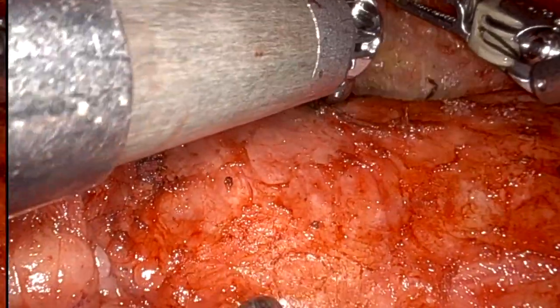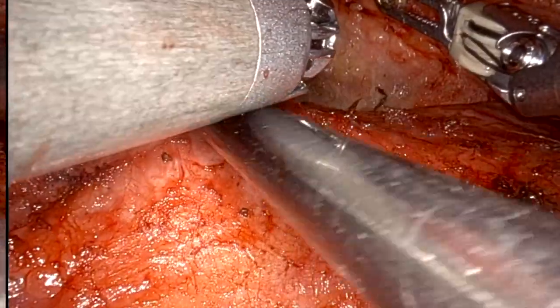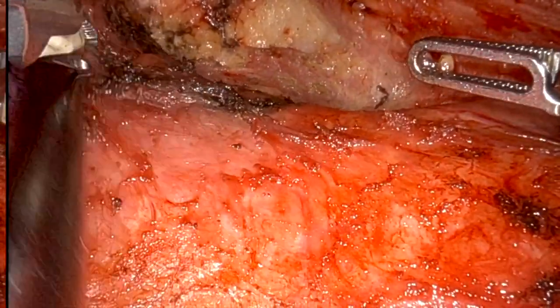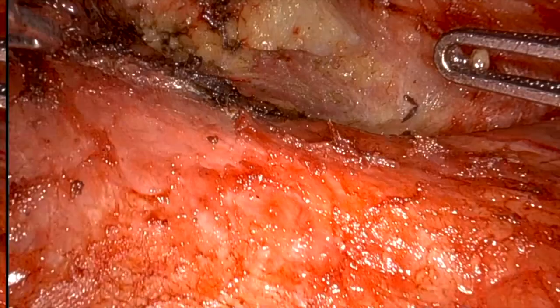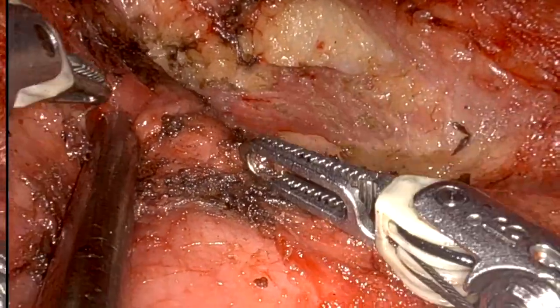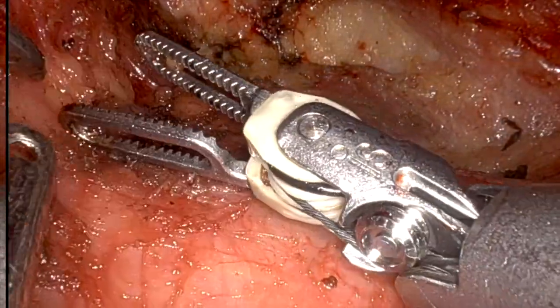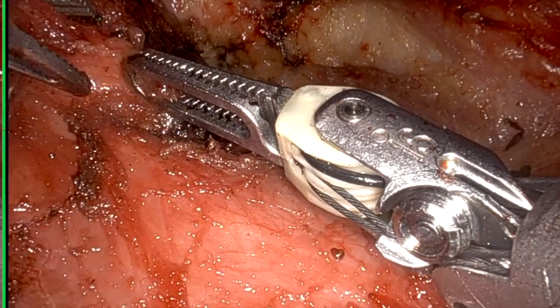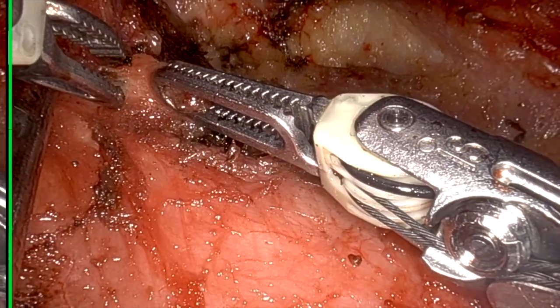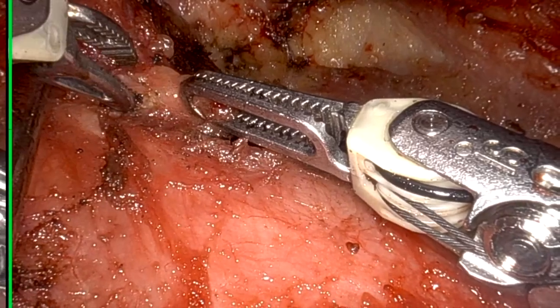So first, I will locate the mandible again. And of course, my assistant will help me because I don't have tactile sensation. His suction is pointing towards the mandible. So this is the lower end of the mandible, the angle of mandible. I hold the tissue with fenestrated bipolar and start dissecting. Gentle layer by layer dissection.